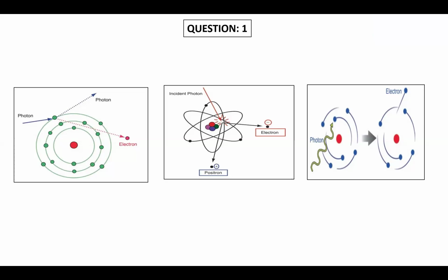Okay, sir. Whatever the scattered dose from the patient, you have surrounding dose in the X-ray room. That's the reason we have lead doors and lead viewing glass. Yes, sir. We are just protecting from these scattered photons. Okay, sir. Can you tell something about the PET principle?